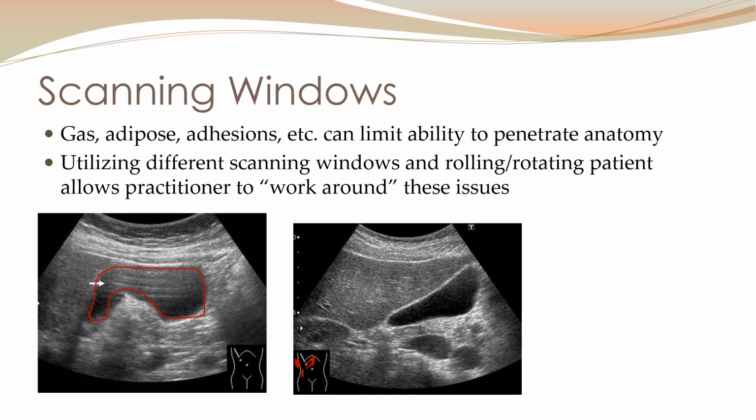Now that being said, all of my sonography friends would kill me if I were to pretend that you could always get a good image from just changing windows. Sometimes we are definitely limited by the patient habitus or bowel gas or a number of different other things. So sometimes improvement's not possible, but much of the time it is, and being willing to try some different windows can really help get you some better imaging.